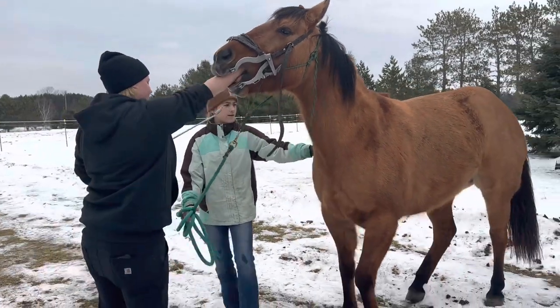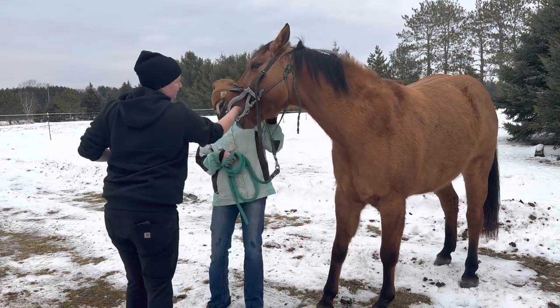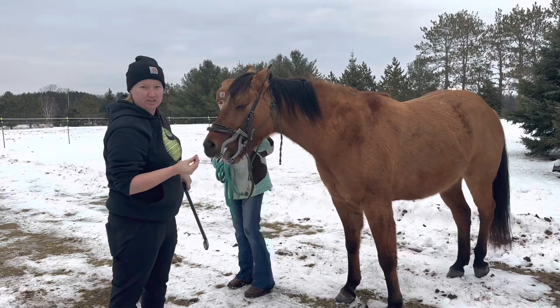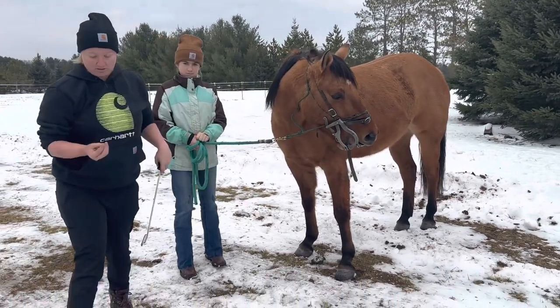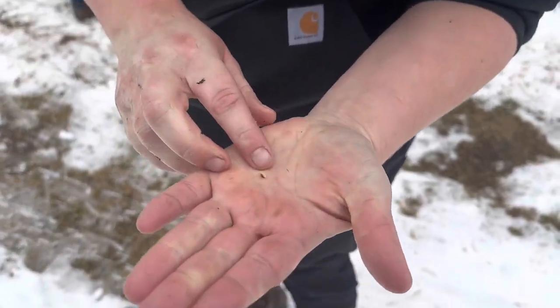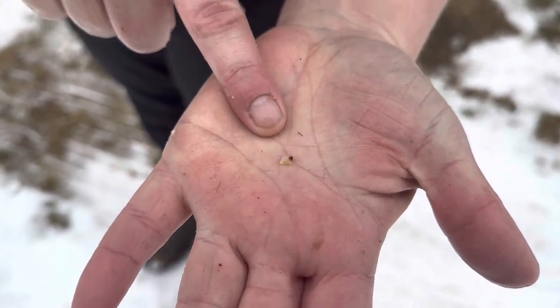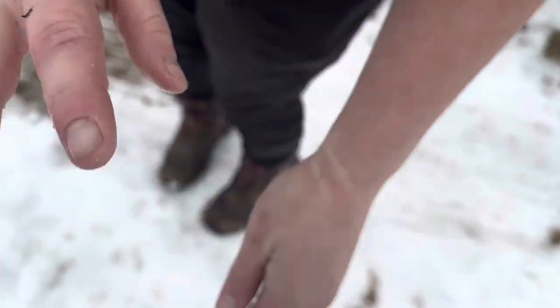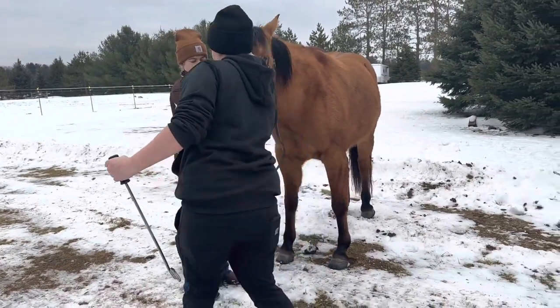Now, she has a really narrow mouth conformation. What that means is any little point that forms is gonna cut into her cheeks. So she is definitely gonna be checked every 6 months. And if you want, you can come see, zoom in on one of these points here. And you can see the size of that in comparison to my fingertip. That is quite large for that to be in her mouth. So we got those taken care of.